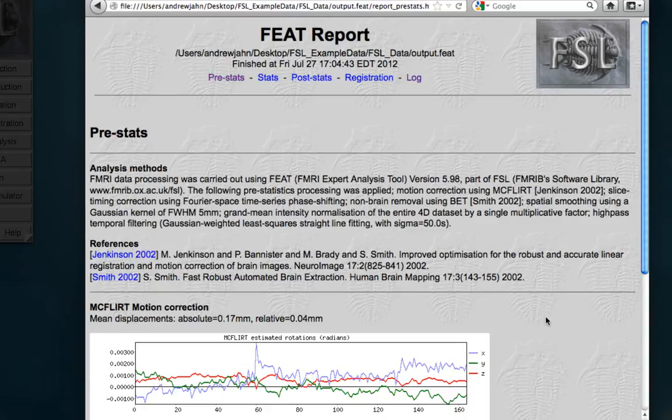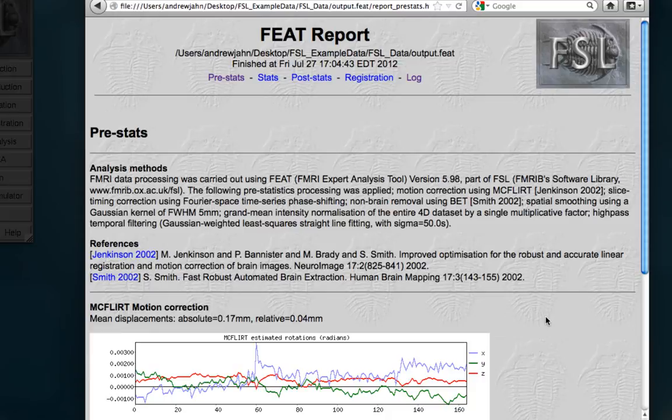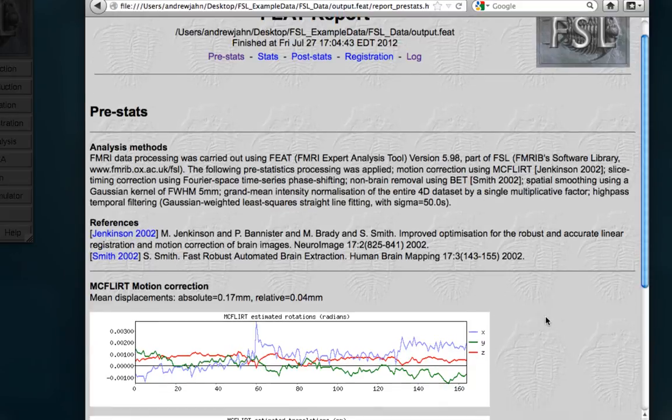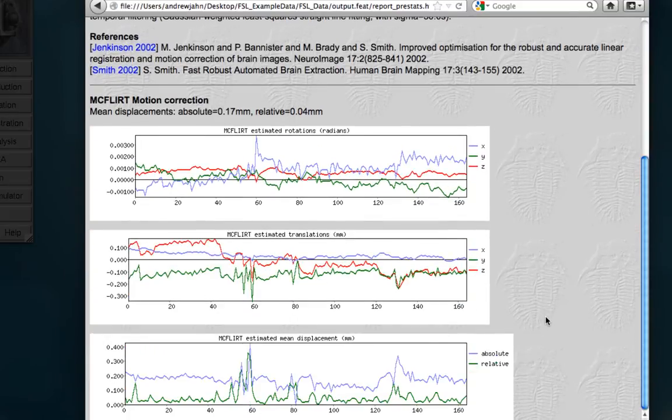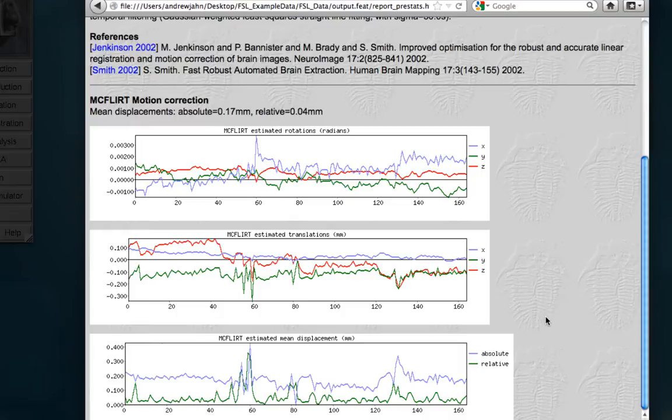All this does is show you the results of the motion correction from mcflirt. Now, a good rule of thumb is any sudden motion that's more than, say, half of a voxel size is cause for concern, something you might want to investigate further. However, in this case, everything seems to be within reasonable bounds. Nothing exceeded just a few tenths of a millimeter. So, that all looks good.